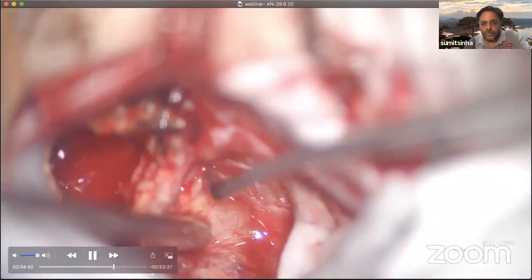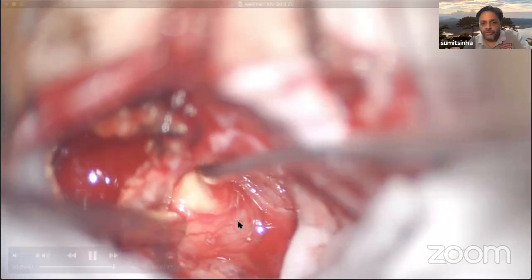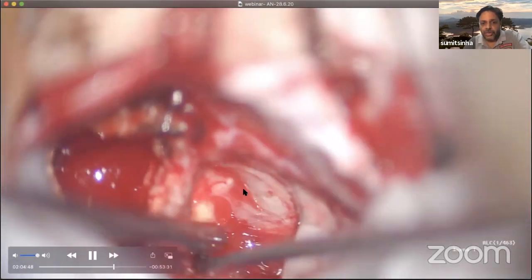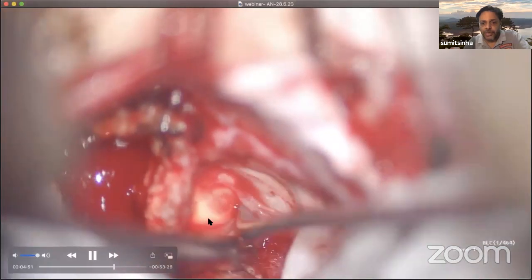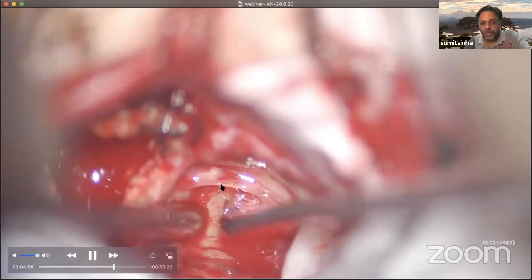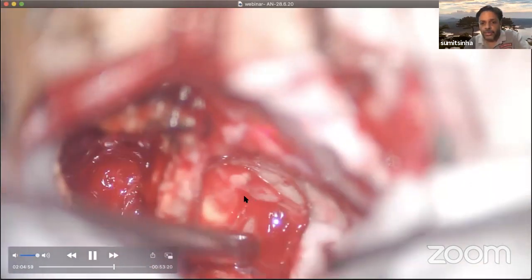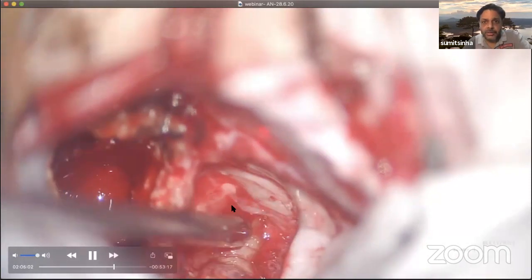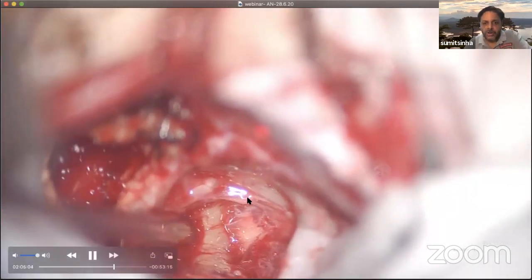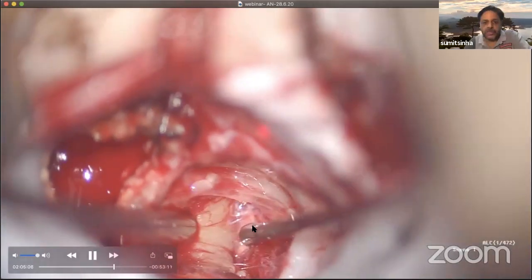So take your sharp dissector, and then you dissect the tumor away from the facial nerve. No arachnoid between the facial and the tumor capsule. You see, this is the 7th-8th complex over here. This is the cochlear nerve, where you see both. Can you see that? I mean, is it clear? This is the cochlear nerve, this is the facial nerve, which is very clearly seen.